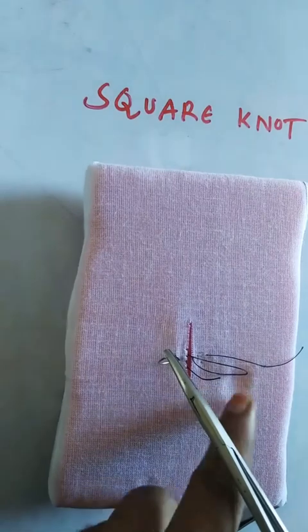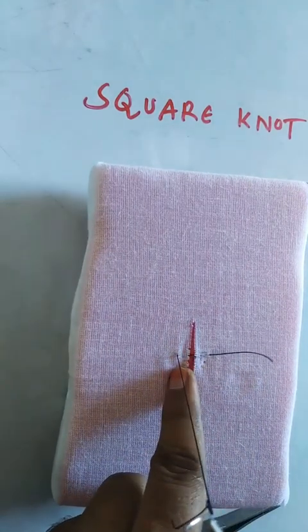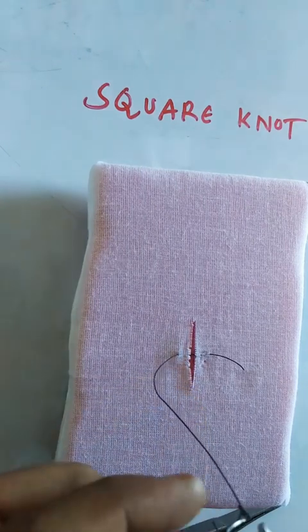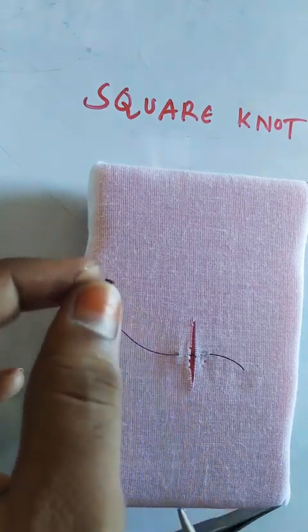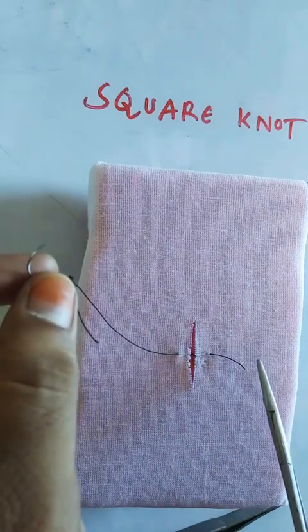You can use tissue holding forceps and pull the suture material through the tissues. Then we have a long end of the suture material and a short end.